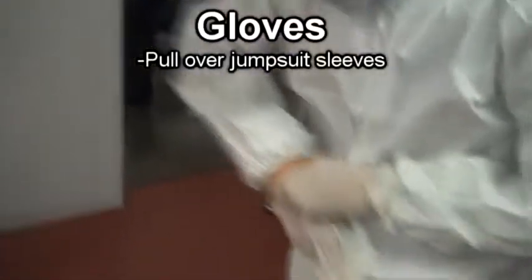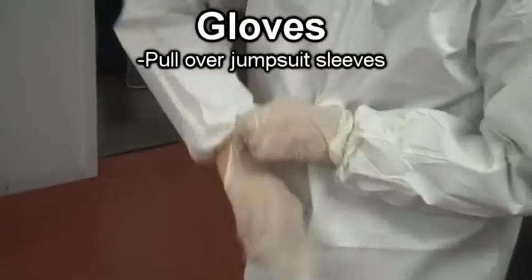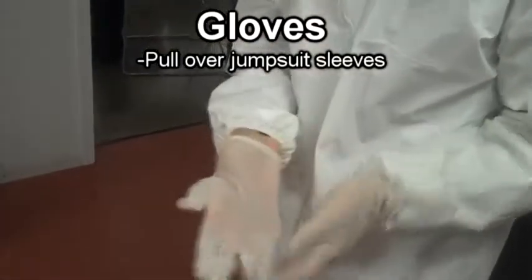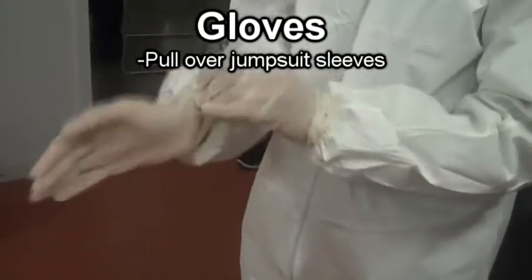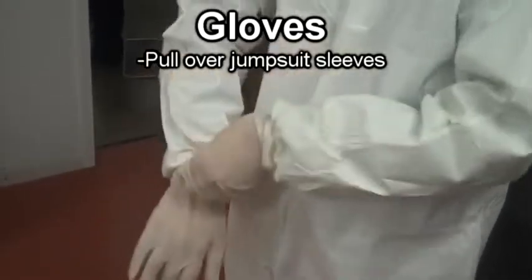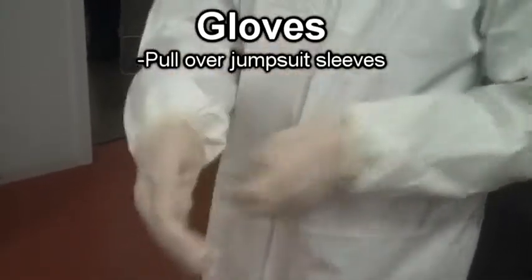It's time to put our gloves on now. All gloves are located in the storage cabinet on the left of the door when you enter into the gowning room. Find the gloves which correspond to your hand size and put them on. Make sure you tuck your jumpsuit sleeves into the gloves when you put them on.